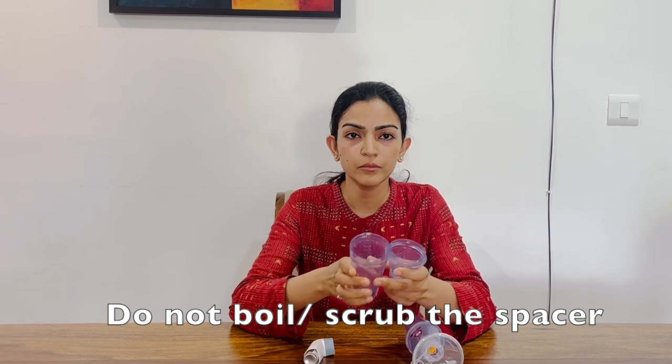Now how to clean this spacer? This has to be cleaned once a week in normal water, it doesn't have to be boiled. So you can dip it in water with mild detergent or wash it under running water and leave it in the air to air dry. Do not wipe it with a cloth or scrub it, otherwise the surface becomes irregular and the medicine will get deposited inside the surface.